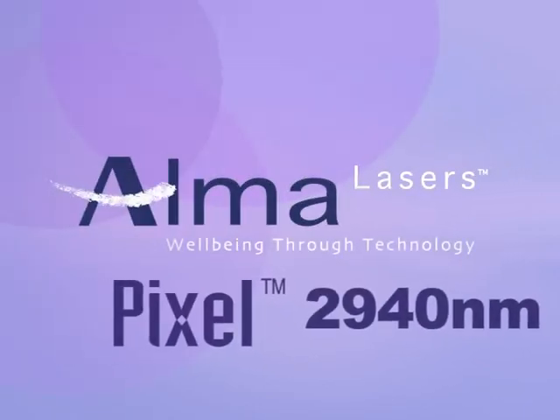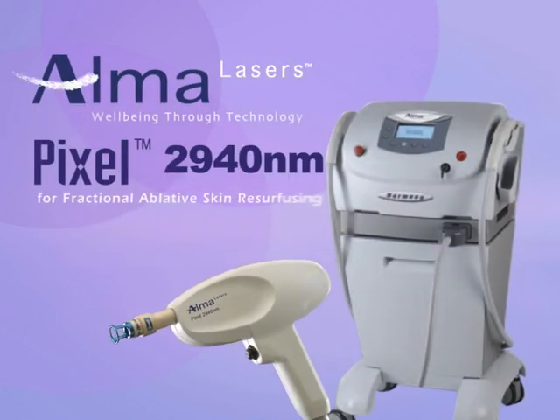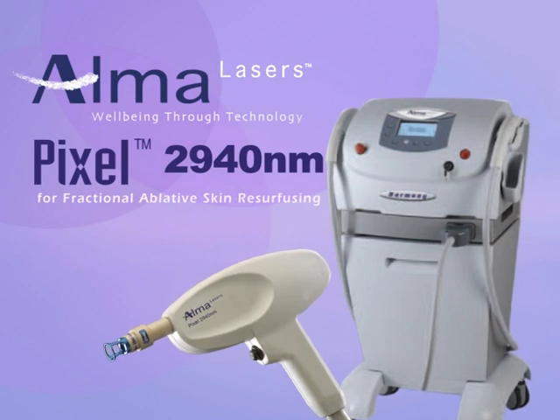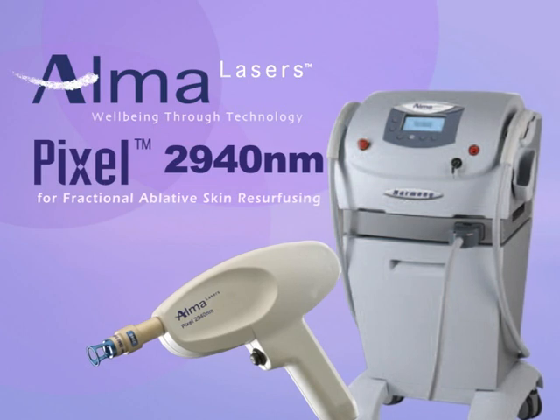Alma Lasers is proud to present its Pixel Module for the Harmony System for skin resurfacing and the treatment of fine lines and wrinkles, skin laxity, scars, melasma, and other skin irregularities.